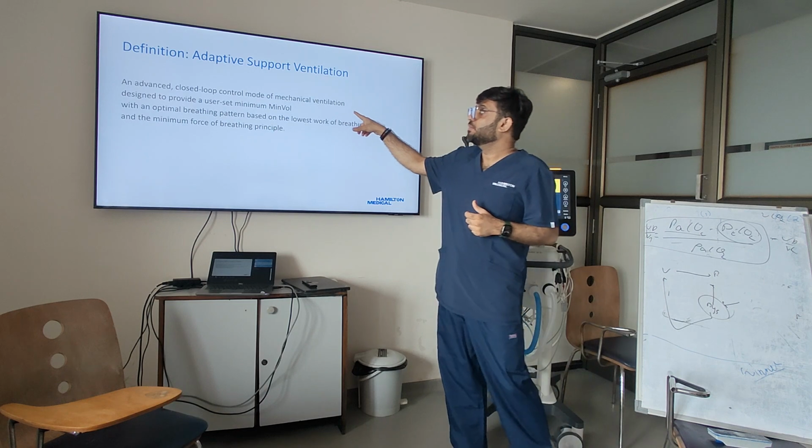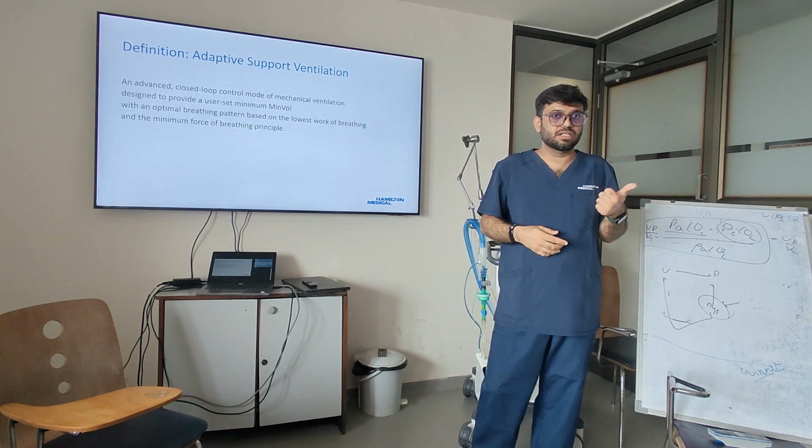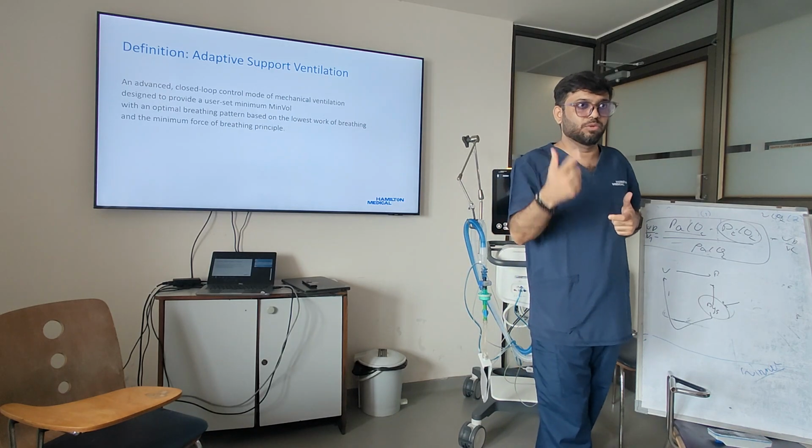Once you set the minute volume target, the machine then analyzes the patient's compliance and resistance in the form of one value called the time constant.